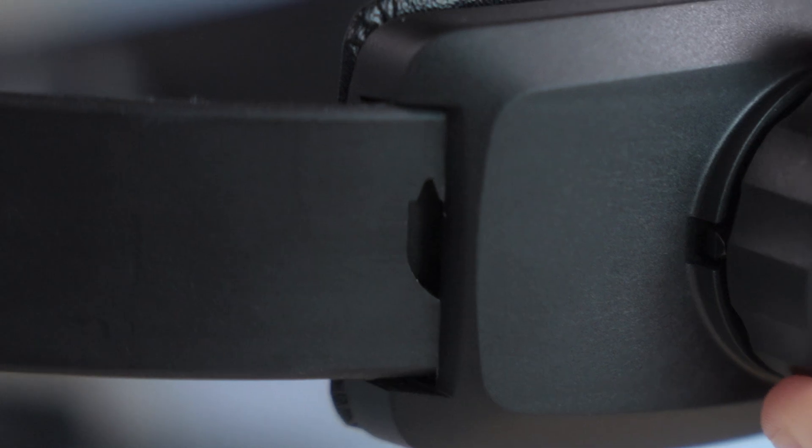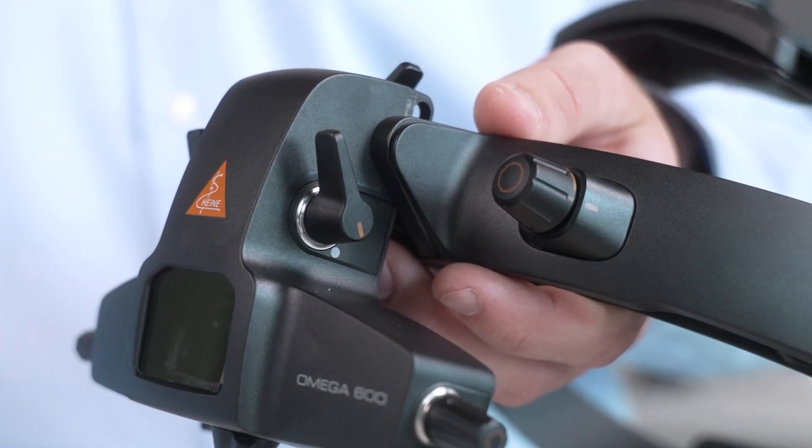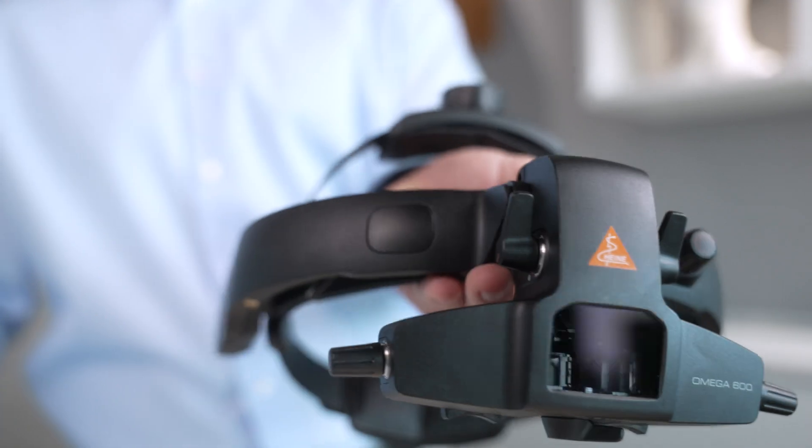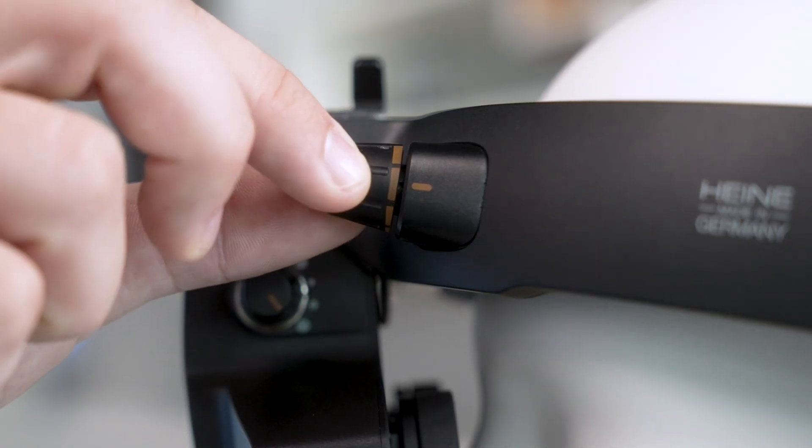Before we dive into the setup, let's take a quick look at the components. You'll notice the headband, which provides a customizable fit, and the optical unit where all your adjustments — like setting filters, apertures, and the pupillary distance — will happen. There's also the brightness control dial on the side, which we'll use shortly.